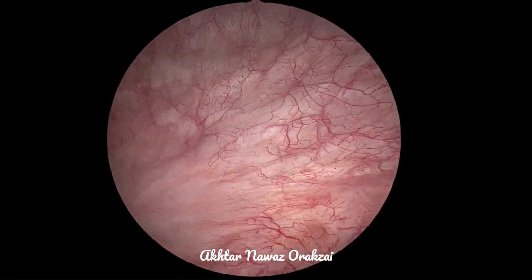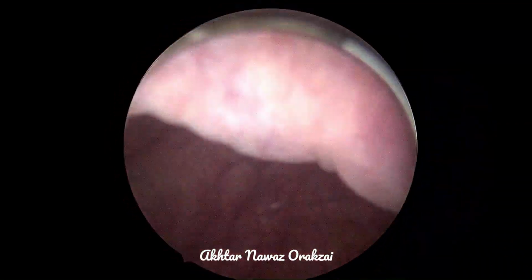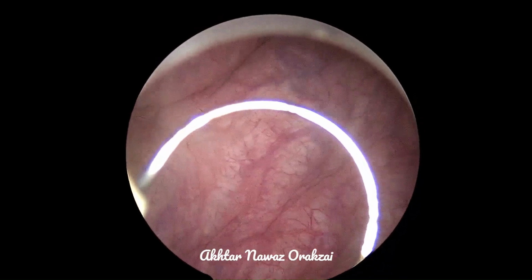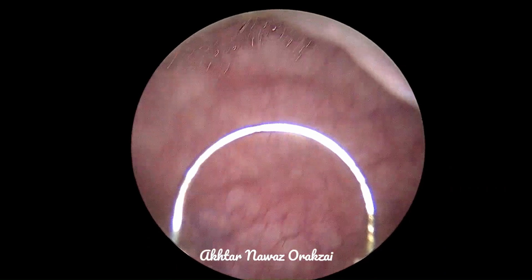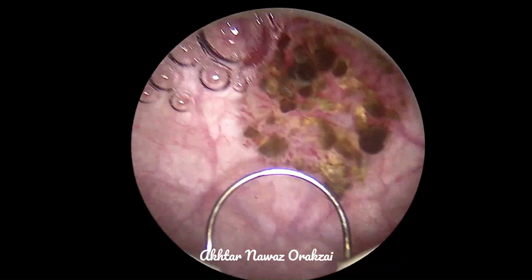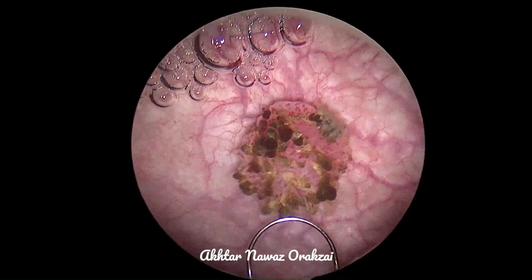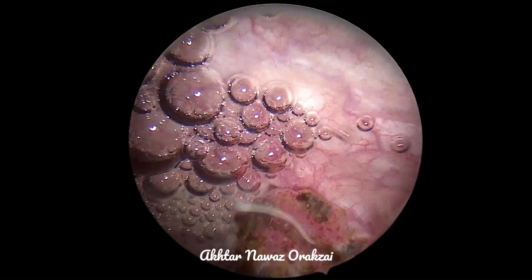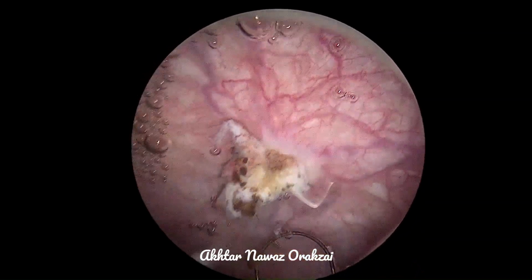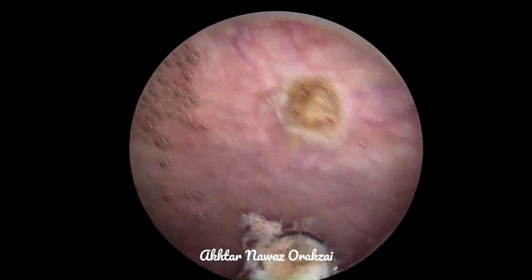So we have seen all the walls, because if you are not seeing and looking for the tumor, it is highly likely that the tumor will be missed. Each and every corner of the bladder needs to be inspected. Majority of the times I have seen the beginners, they are too close to the mucosa, so they see a very narrow and very small area.